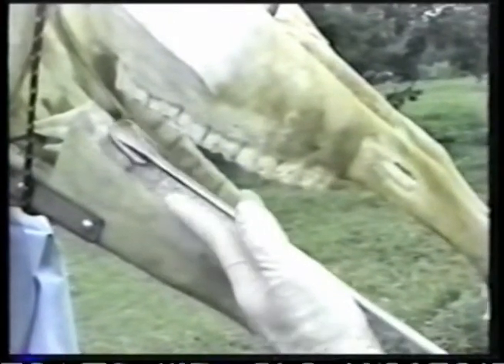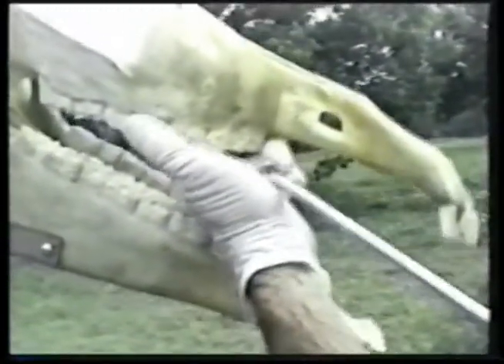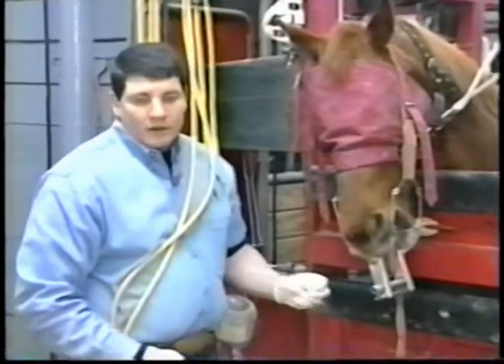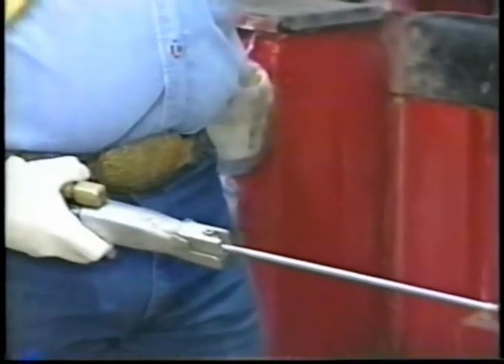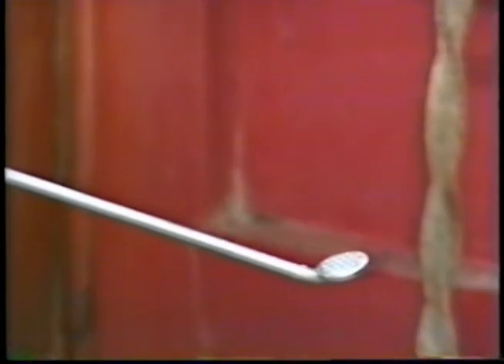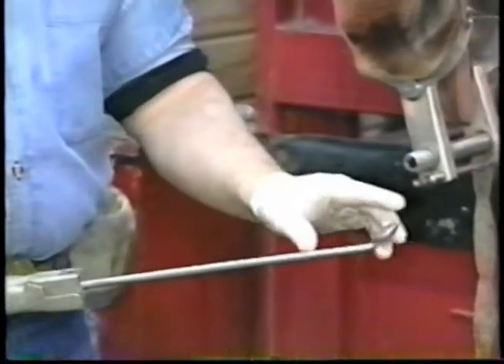That finishes the front portion and sculpts each tooth from front to back with the exception of the last two teeth. We've done the majority of the work with the 20-degree push cut blade. Now we're going to use the 22-degree round blade so that we can work the enamel ridges on the outside edge of the tooth, as well as the upper buccal points on the upper arcade and some tall points, rounding those points without damaging any of the soft tissue.